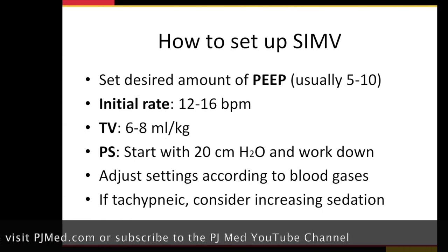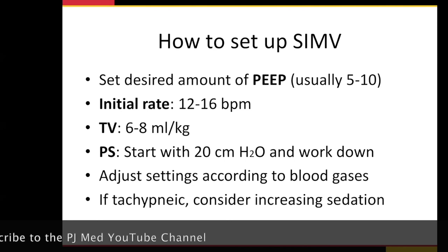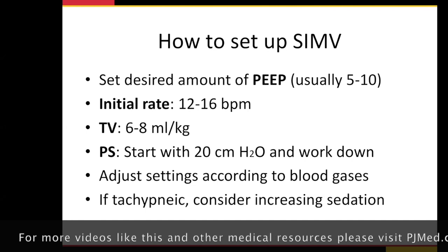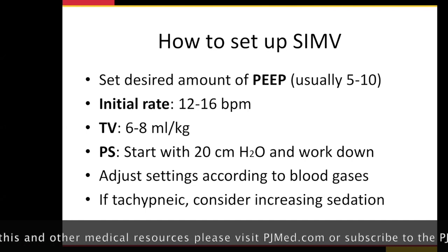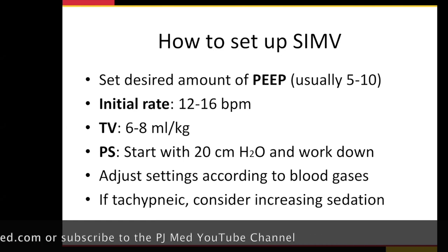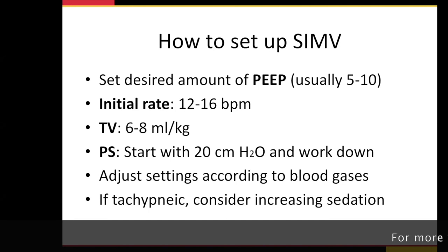These are some things you can do to adjust it. If they're really breathing fast, the answer most of the time is they need more sedation, okay? That's the answer. If you paralyze them, that's fine. We're not afraid to paralyze these patients. Where I work in the lung rescue unit, the ECMO unit, that's what we do with these patients when they come in. They're that sick. They have no lung that's participating. We put them on ECMO, and we still ventilate them a little bit, but we usually have to paralyze them because if they're not paralyzed, their diaphragm will try to breathe for them.